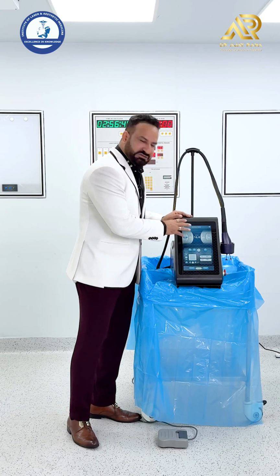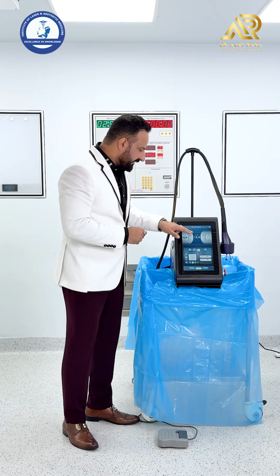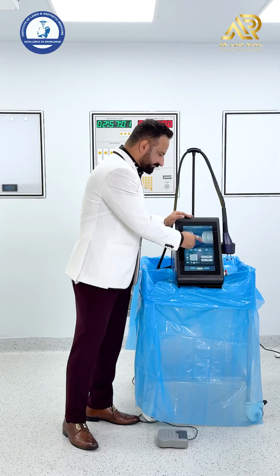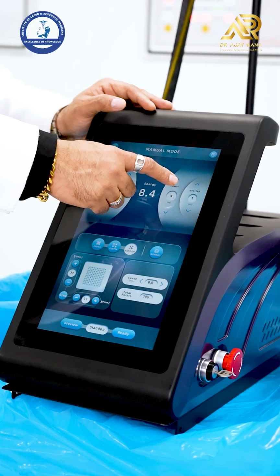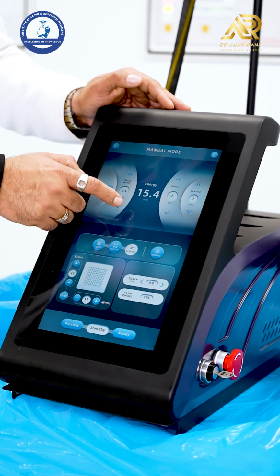What you can see here is, like any other platform, the wavelength is fixed, 1927 nanometers. Then we have the energy. You can increase or decrease the energy. Then you have the pulse width. You can increase or decrease the pulse width.